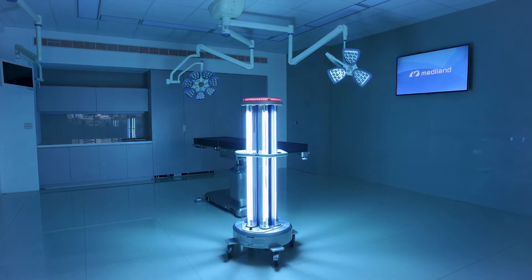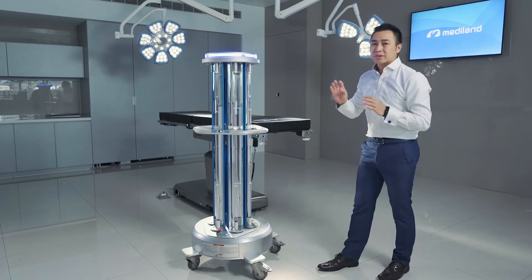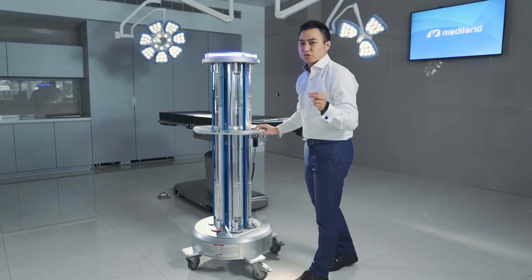The walking distance is about five meters and it only takes five minutes for each spot to process the disinfection. For this room, we only need three spots — a total of 15 minutes to deliver the disinfection.